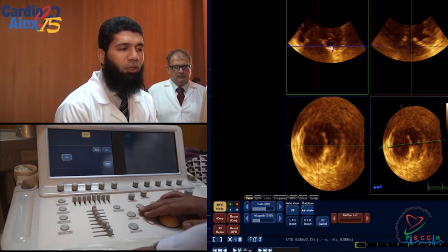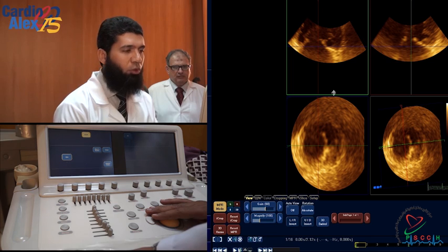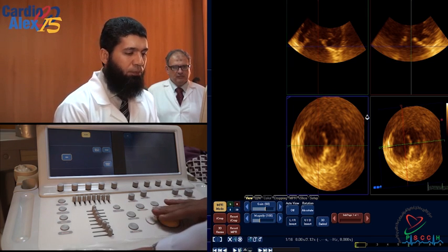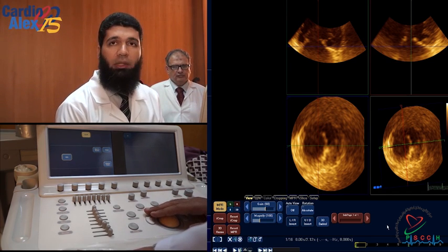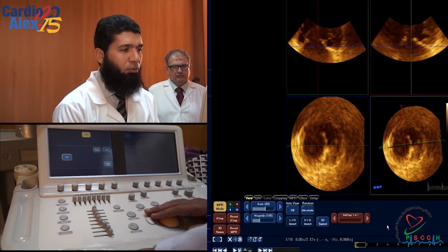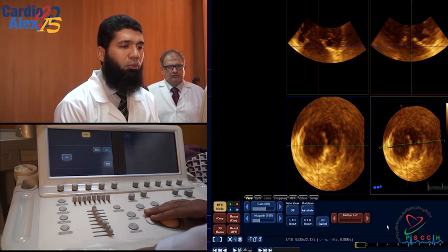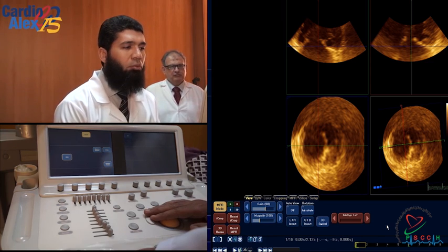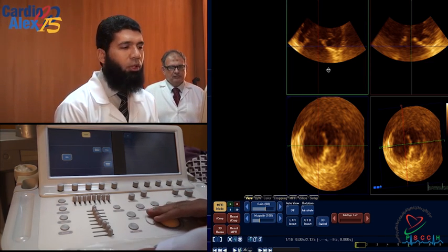So how to calculate the mitral valve area for mitral valve stenosis cases by 3D. In 2D, in the short axis view of the mitral valve, you cannot guarantee that you are exactly at the tips, because actually you are just imaging in one dimension. But here, although we are going back to 2D, here it is oriented 2D. I know at what level I am putting my lines.